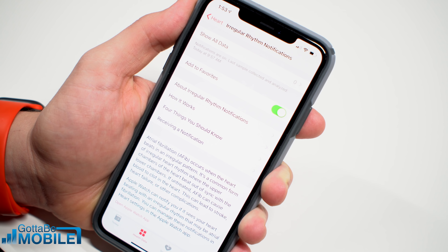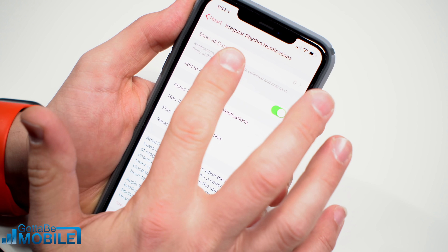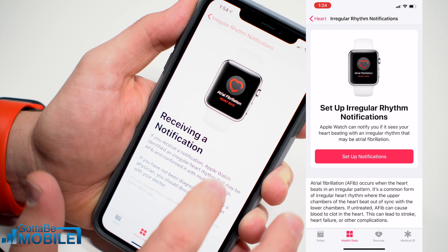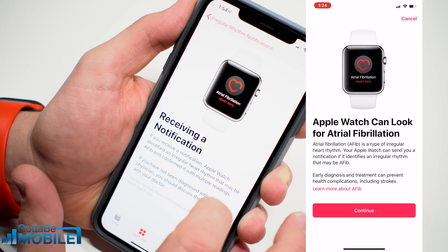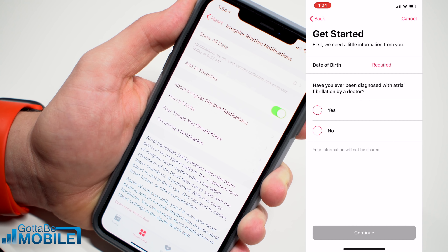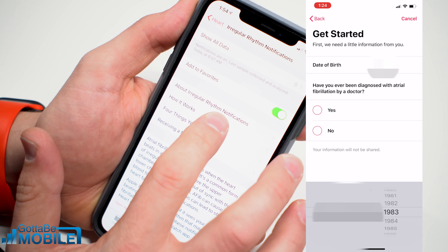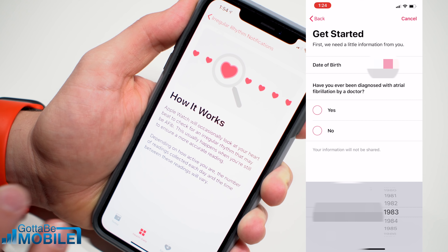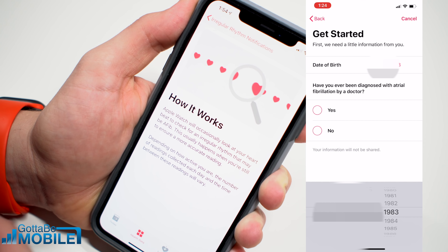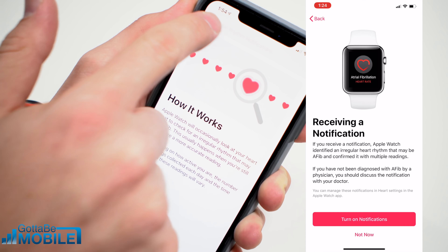Even if you don't have an Apple Watch 4, you're going to be able to set up irregular rhythm notifications, and you get a prompt for this as you get started. Basically it's going to let you know if you have an irregular heartbeat and it's something that maybe you should get checked out. Apple is going to alert you to this, and then you need to go visit a doctor and seek out more information.